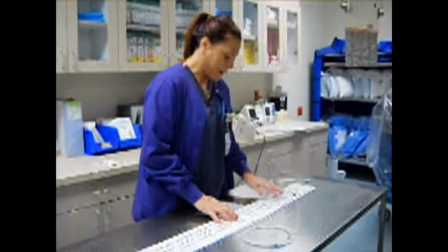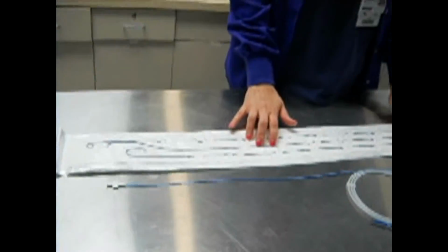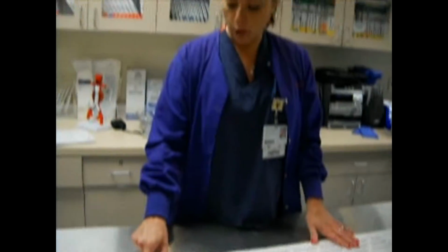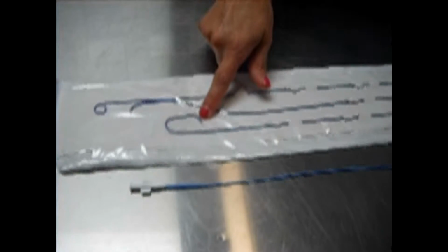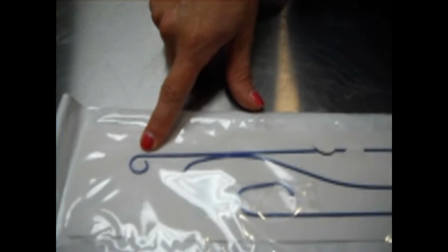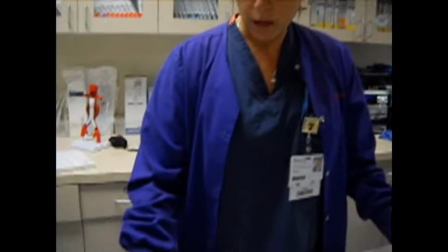Here I have the 3 different catheters we use throughout the test. As you may have noticed from my previous speech, I showed you the different coronaries. You have a JL4 here, which is a Judkins left catheter. This is for your left system, looking at your LAD and your circumflex. Here is your right catheter, your JR4, or Judkins right catheter. And this is your pigtail. This is what we put into the ventricle to look at the pumping action of your heart. It's called a pigtail because it looks just like a pigtail.